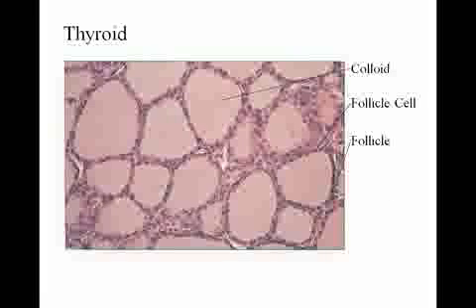Name these cells. Good. Name these cells. Follicle cells. Name this pink stuff. What is it?